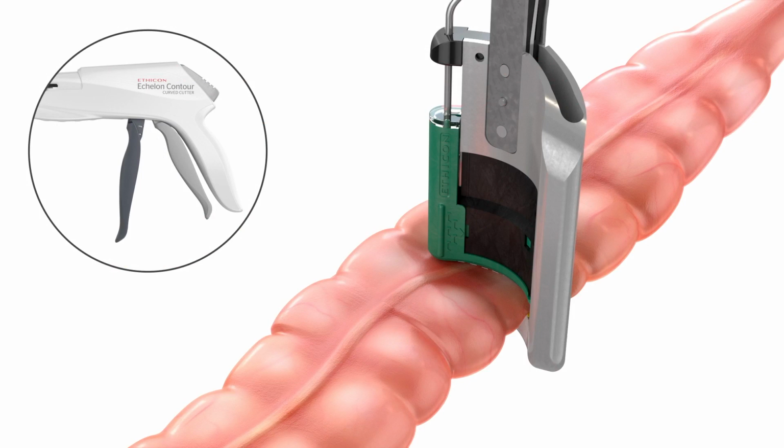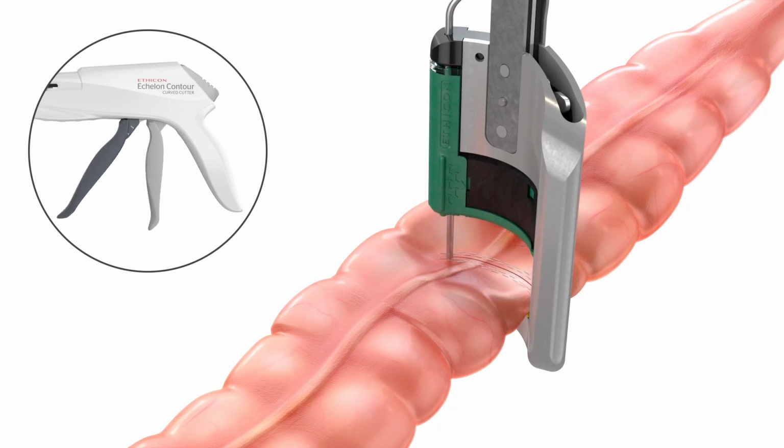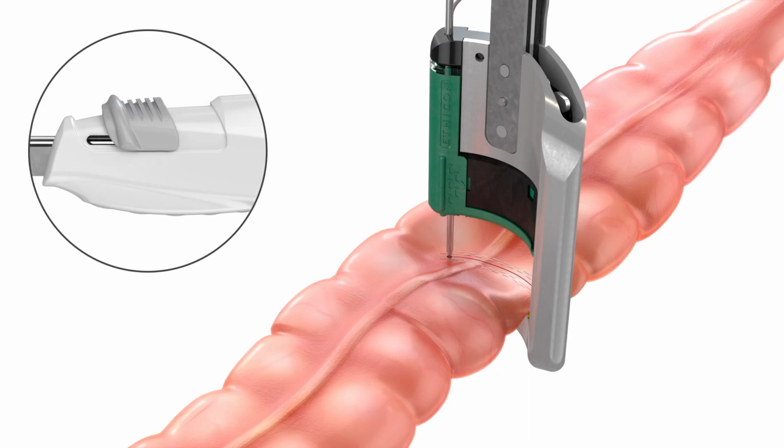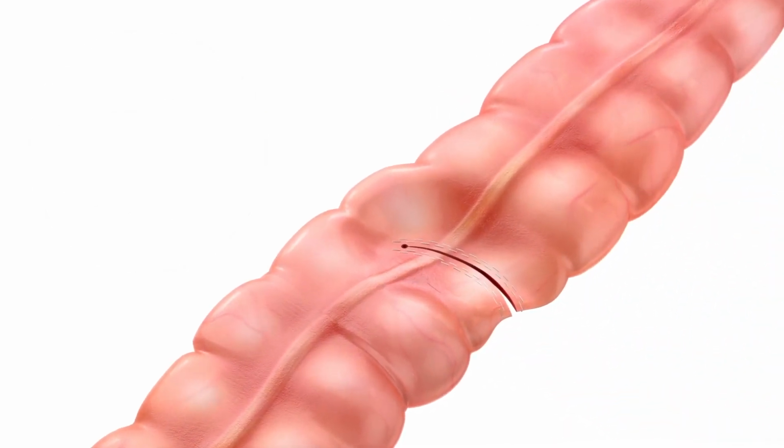After firing the instrument, open the jaws of the instrument by squeezing the closure trigger and pushing the release button with the thumb. Retract the retaining pin manually. Examine the staple line for proper staple formation.